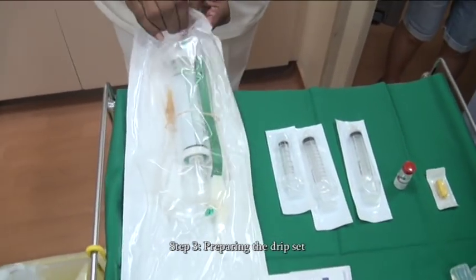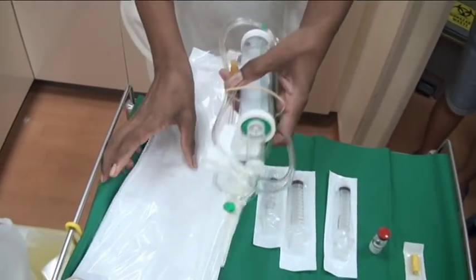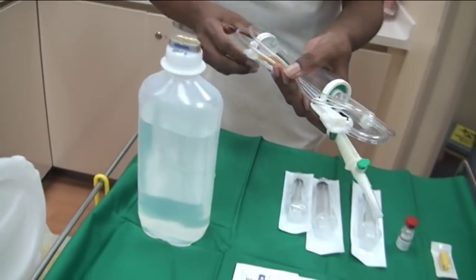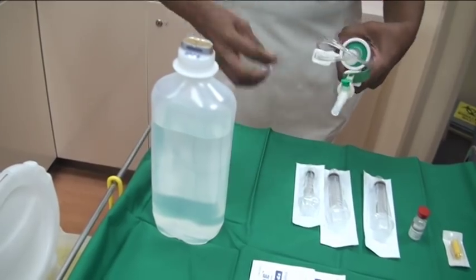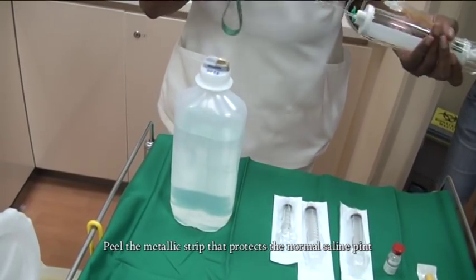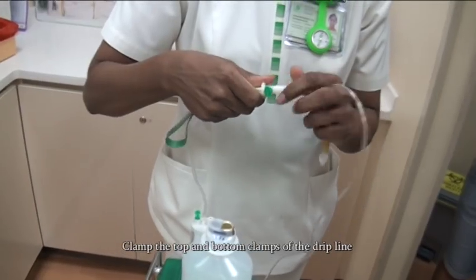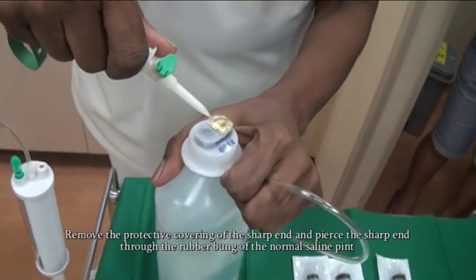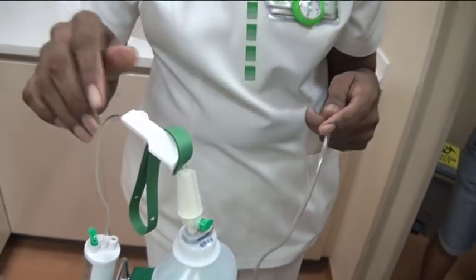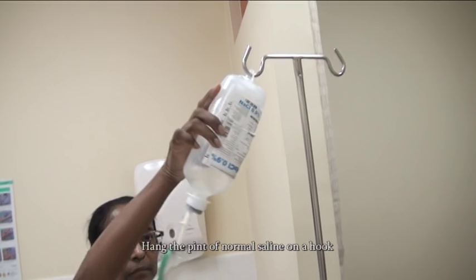Step 3: Preparing the drip set. Open a new burette set — do not reuse an old set. Peel the metallic strip that protects the normal saline pint. Clamp the top and bottom clamps of the drip line. Remove the protective covering of the sharp end and pierce it through the rubber bung of the normal saline pint. Check that the line is fully clamped, then hang the pint of normal saline on a hook.